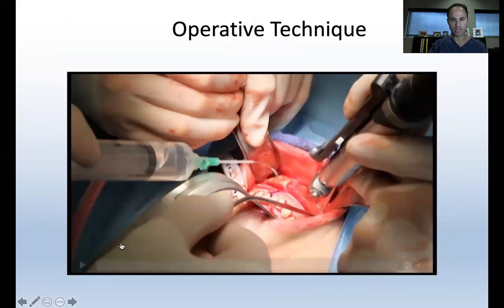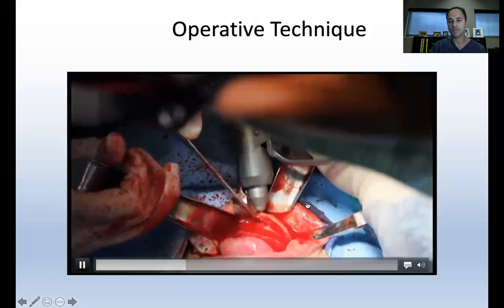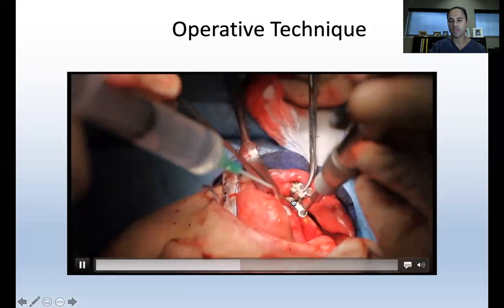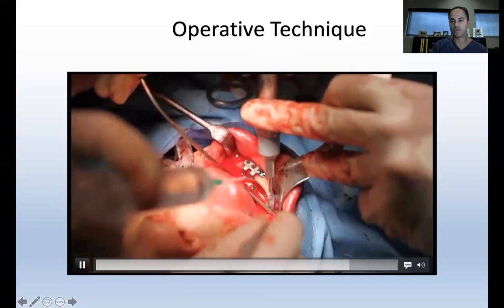So here's her sliding genioplasty. We use a sagittal saw here, followed by screw fixation of the distal portion. We use an L plate. We secure the superior aspect of the plate with 2.0 millimeter screws at the interdental papillae. We advance the chin and fixate it with 2.0 millimeter screws and then use a paraburr to taper the edges.